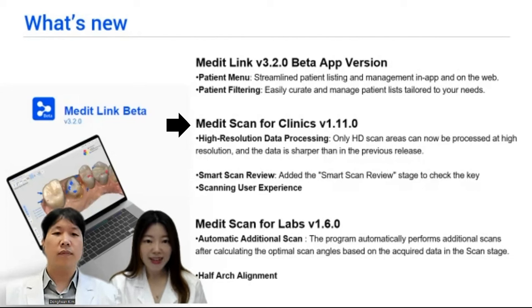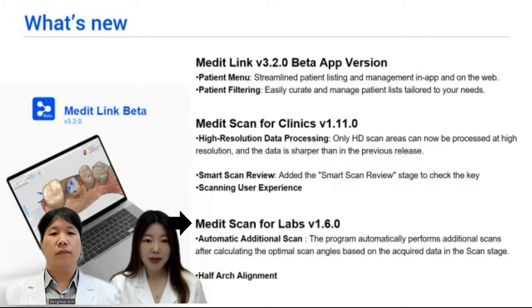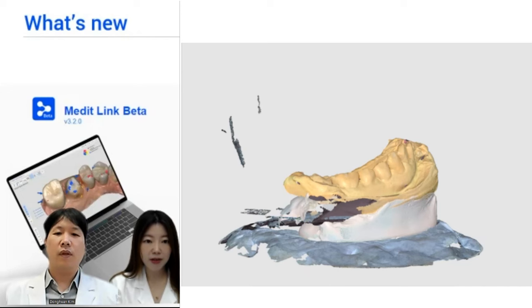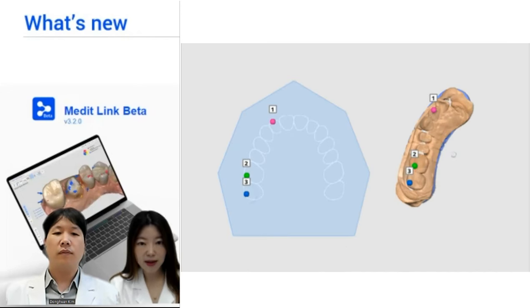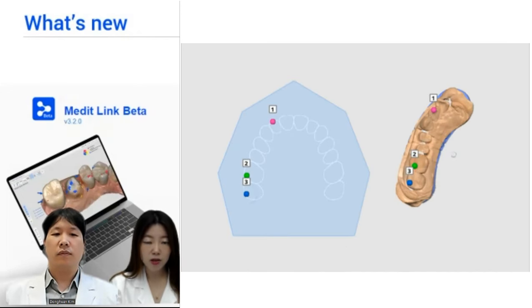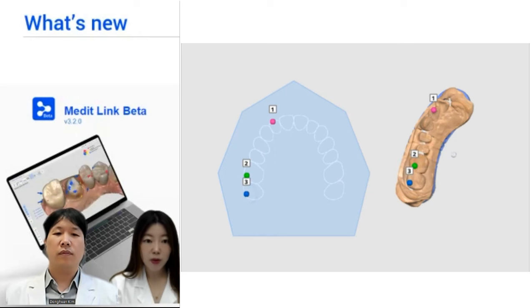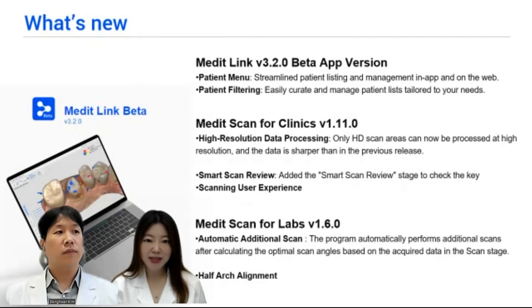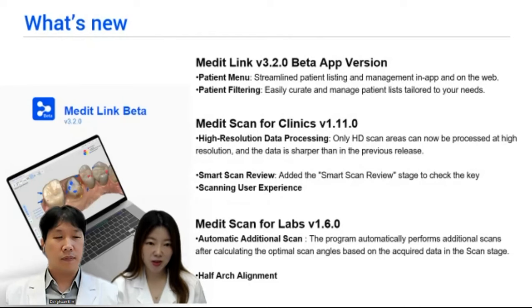Last, for MEDIT Scan for Labs: the program will now automatically perform additional scans after calculating optimal scan angles, and half-arch alignment is available. That's all about the improvements and new features — please feel free to send MEDIT any feedback.